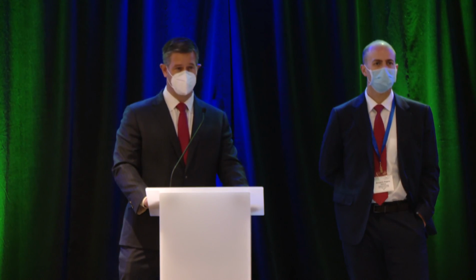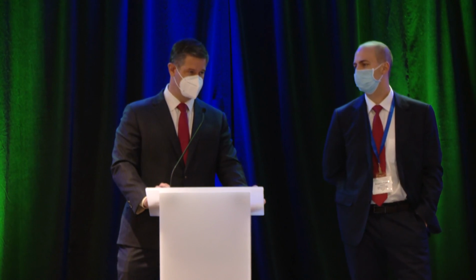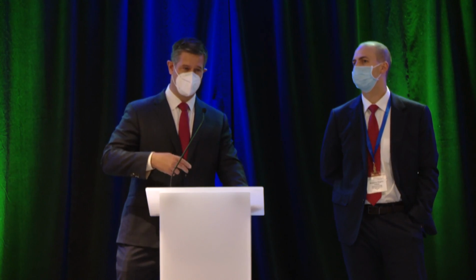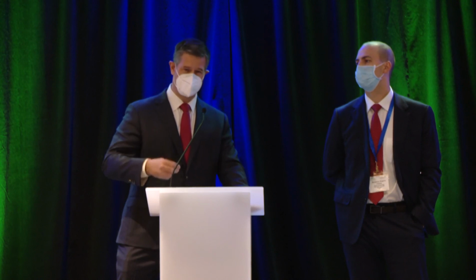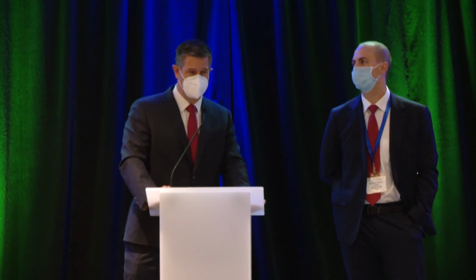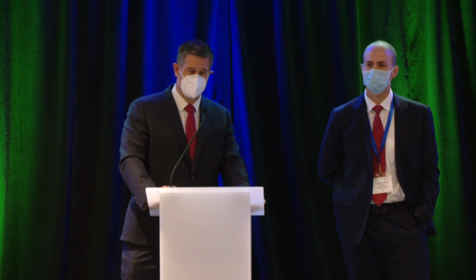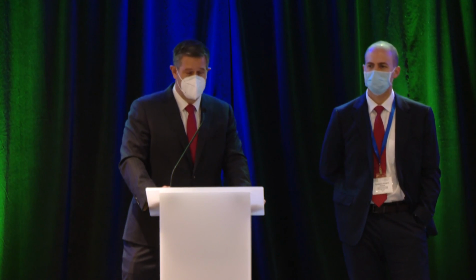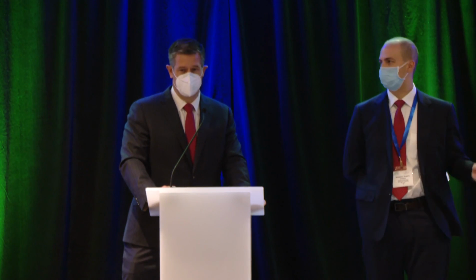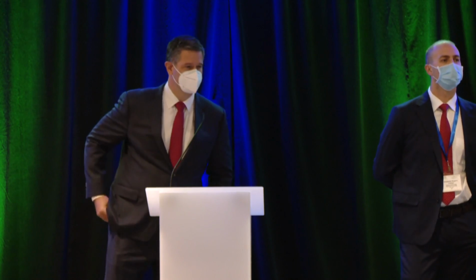And if they were to meet, let's say, the older definition of esophagogastric junction obstruction, and you aren't able to really get the full evaluation, you're probably still going to do those other metrics anyway. You're really not going to be able to call it EGJ outflow obstruction because you're not going to get a reliable IRP. But that's usually not relevant in patients with perisophageal hiatal hernia, because you see it all the time. So, yeah, Prakash.